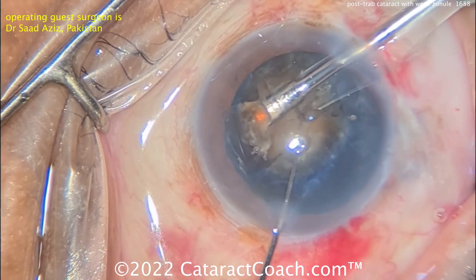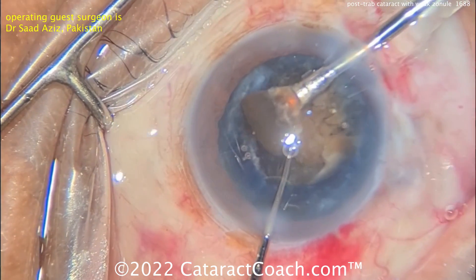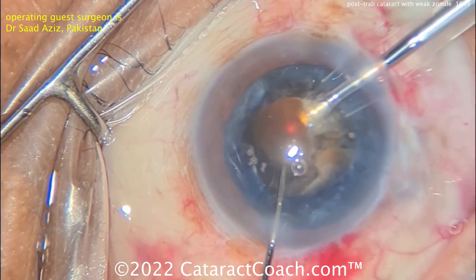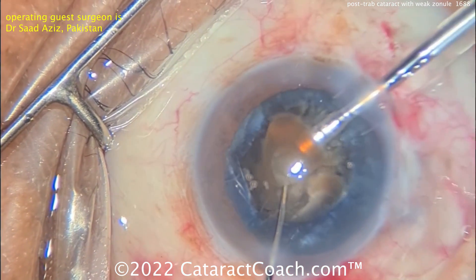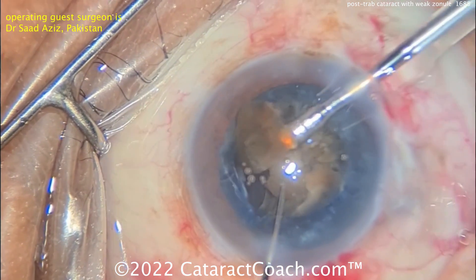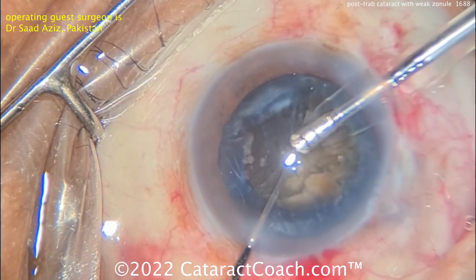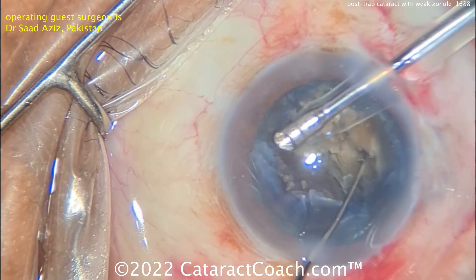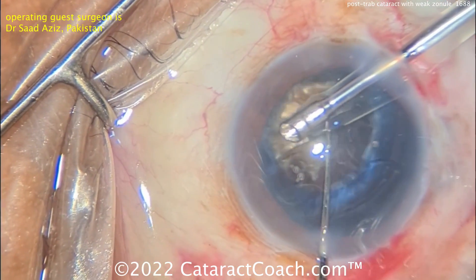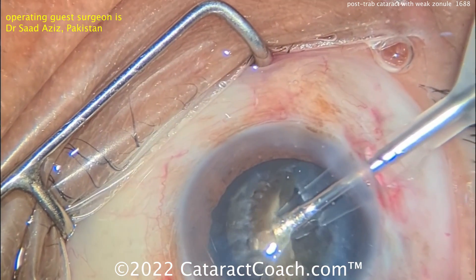Good draping, and incision construction looks pretty good. I like this case all around. Now removing that nucleus — I would sit temporally to operate temporally, but this surgeon looks like they're sitting superiorly to operate temporally. Whatever makes you happy — it's really not that critical. Getting this nucleus rotated, there's a lot more stability now in the capsular bag with that CTR being placed.